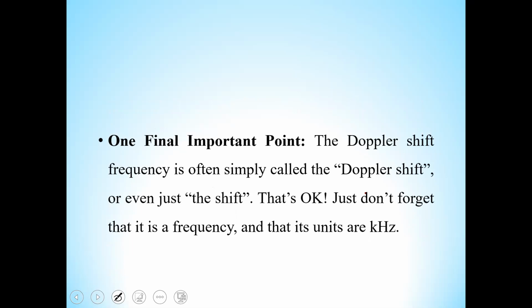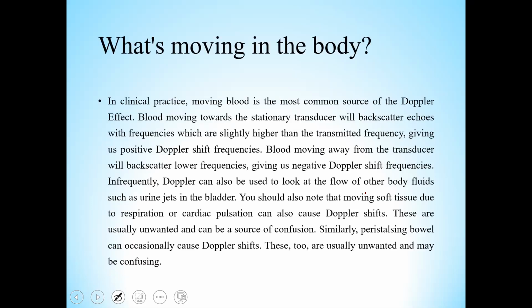One final important point, the Doppler shift frequency is often simply called Doppler shift or even shift. That's okay. Just don't forget that it is a frequency and in the unit of kilohertz.